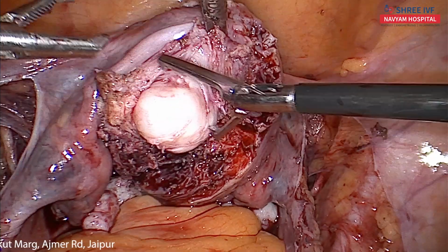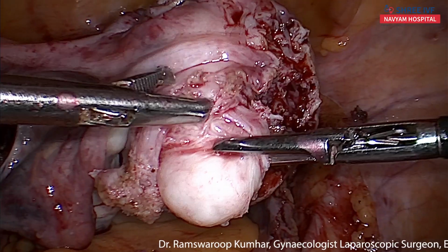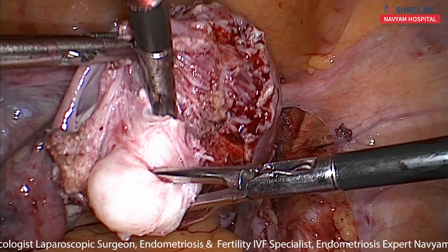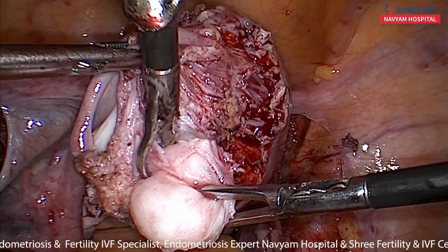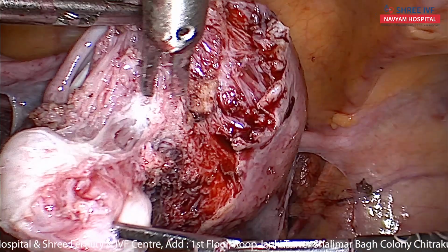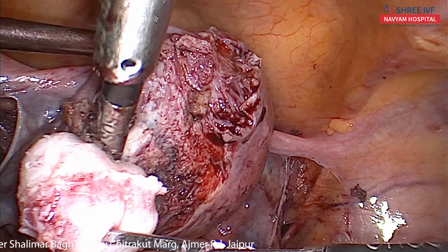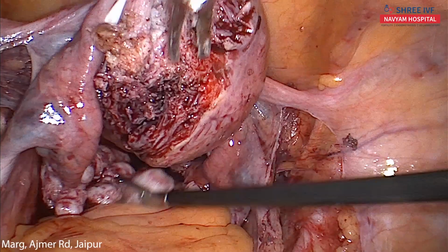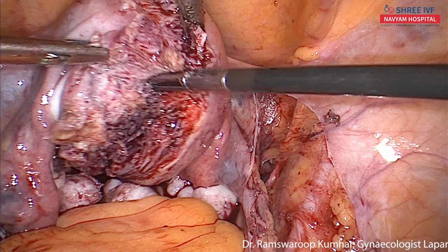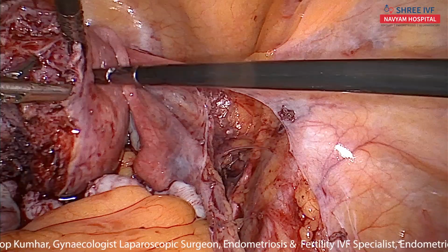The tubes, I think, have gone. 13 myomas are out, and what is left in the uterus, is there any more myoma?